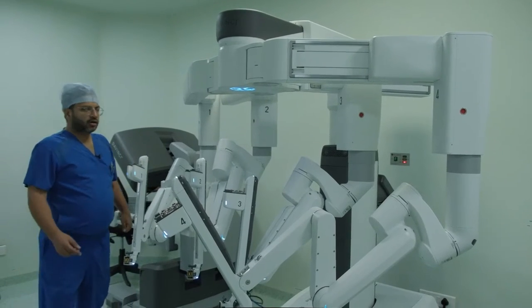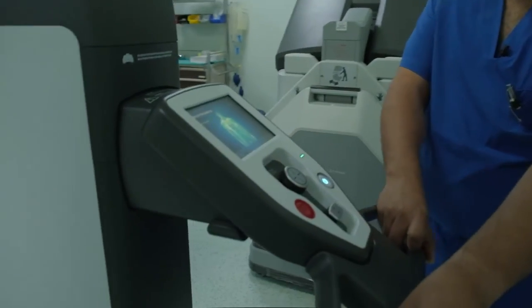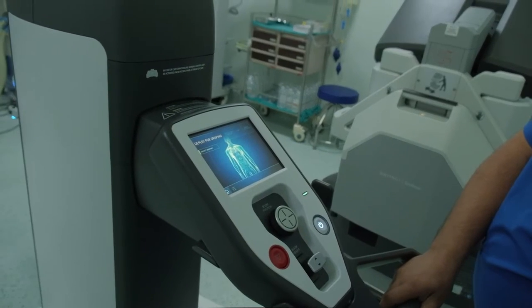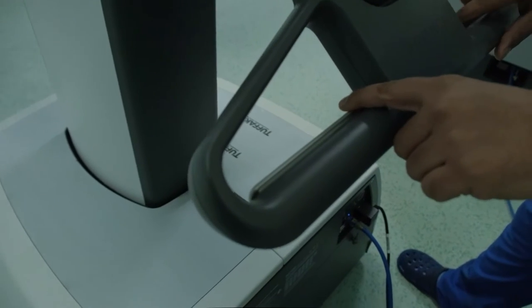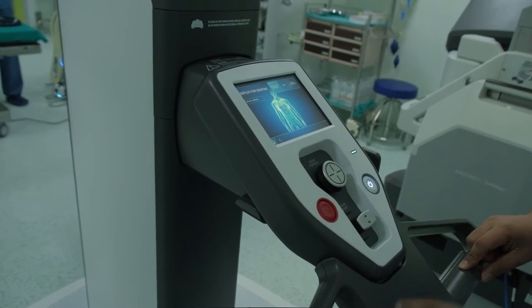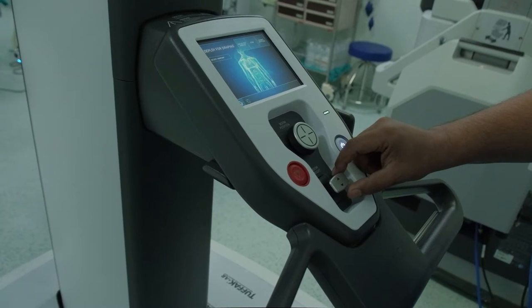Now, coming to the back of the system, this is the touch screen and the controls for controlling the movement of the patient cart. Here is the throttle enable switch, which we press, and that takes the cart forward or backward. The boom position can be changed using these controls, and the boom height can also be changed using these controls.